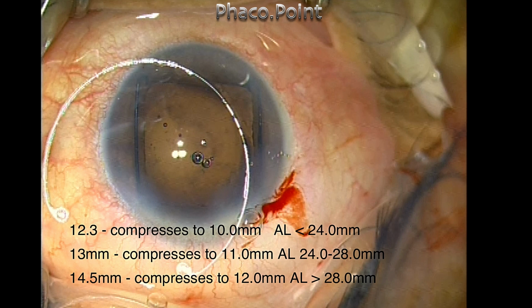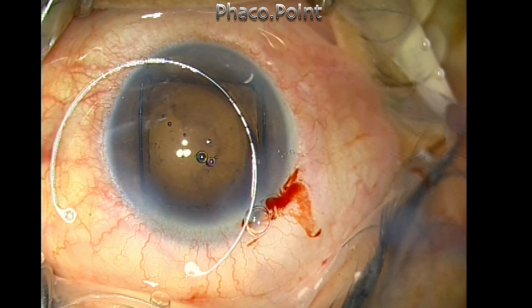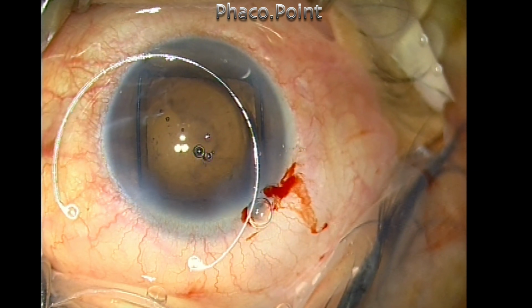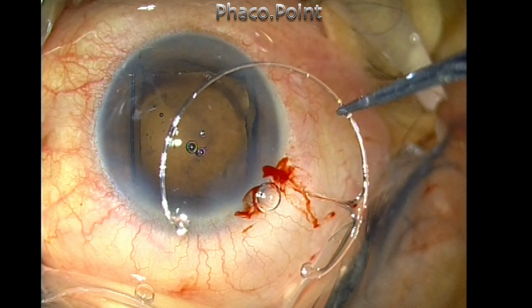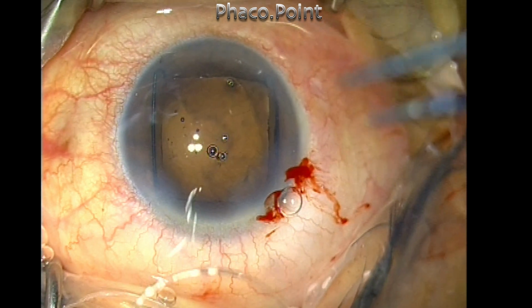Newer CTRs have a small indentation at one end, and this is the end that has to be fed into the eye, because this knuckle will prevent the snagging of the capsule or the capsular bag as you insert it and as you thread it into the capsular bag. This will prevent the worsening of zonular dialysis. The best way is to grip it with the help of two plain forceps.